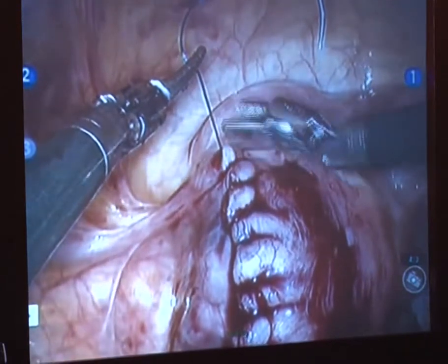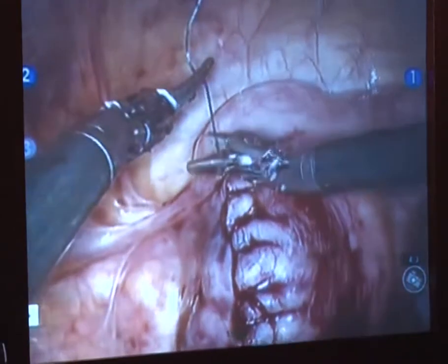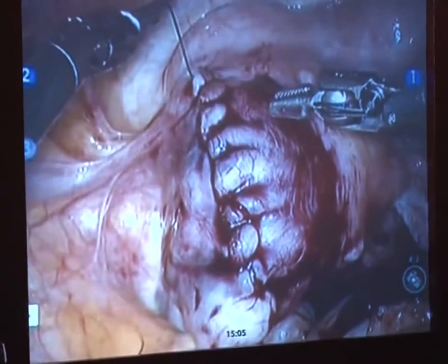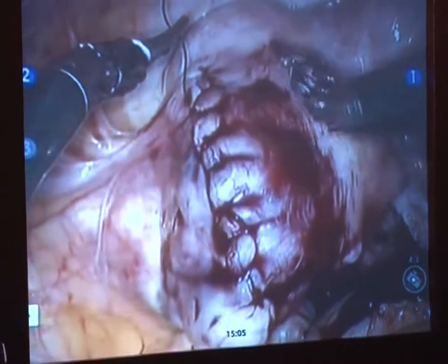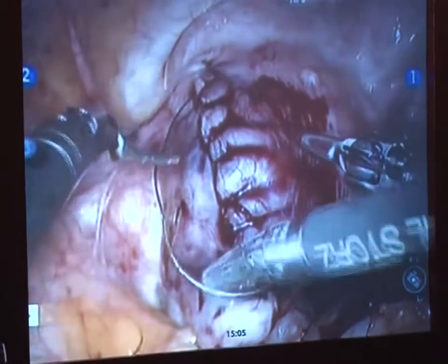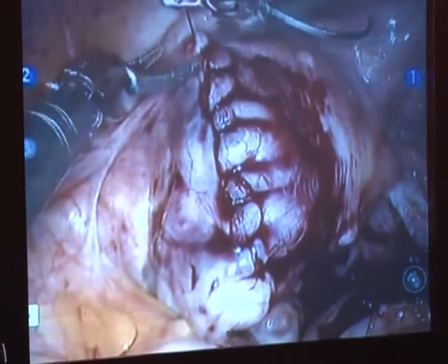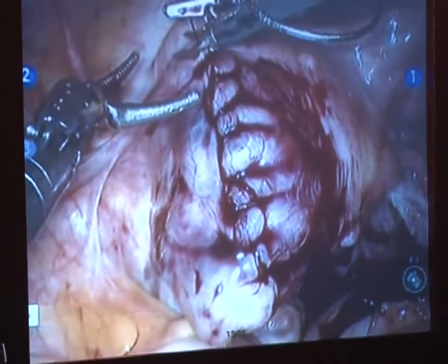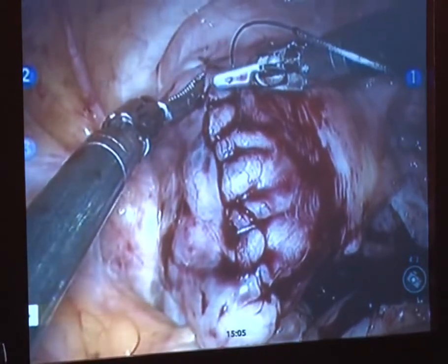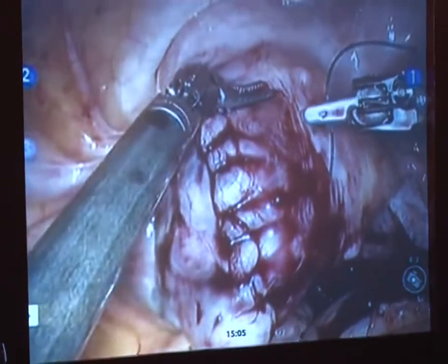You can get the intercede ready, but we don't need it yet. We'll put suction out, if you don't mind. Get this clot out of here, just because any little bit of blood in the pelvis eats up the light, so that way we don't make a dark field. Can you suction all the clot? Go ahead and suction. No irrigation, just suction only. Keep going. A little bit more, just underneath. Okay. Go ahead and let the uterus dip backwards posteriorly. Good.